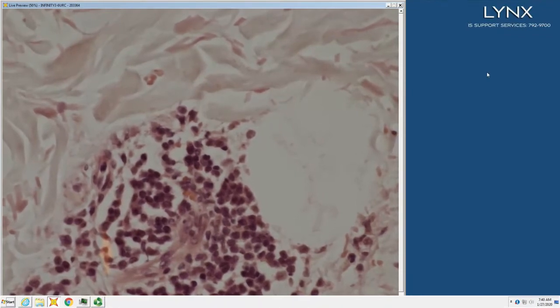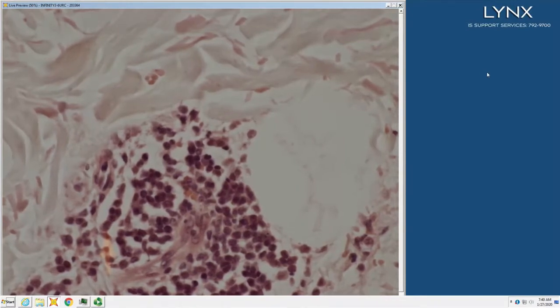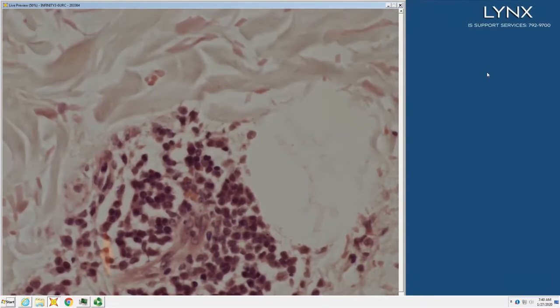So look at the lymphs. We're big pattern people. Go a little closer. Look at the lymphs. In this case, you have large hyperchromatic angulated cells with a rim of cytoplasm. That's a clue to leukemia. And then they stain with CD4 but not CD3. That's another clue to leukemia, and drives you to things like myeloperoxidase and lysozyme, other markers that would help you with leukemia.